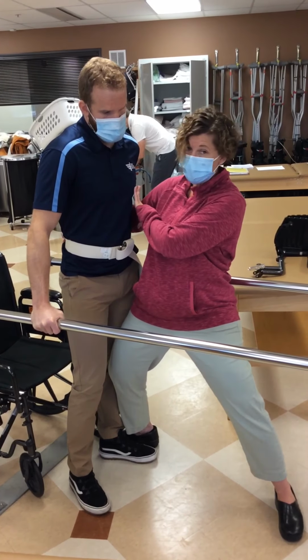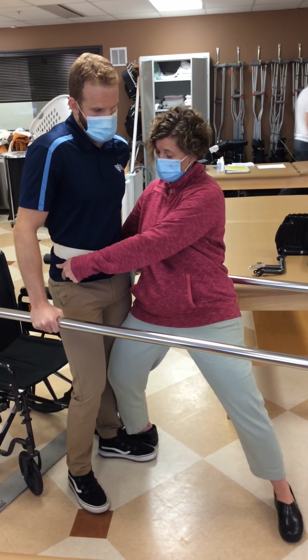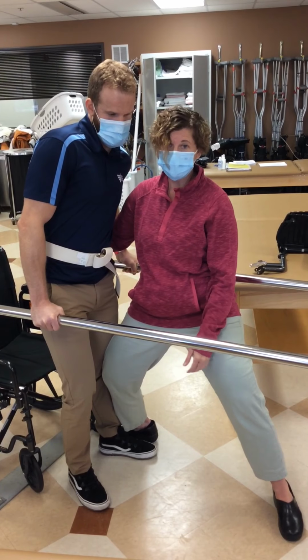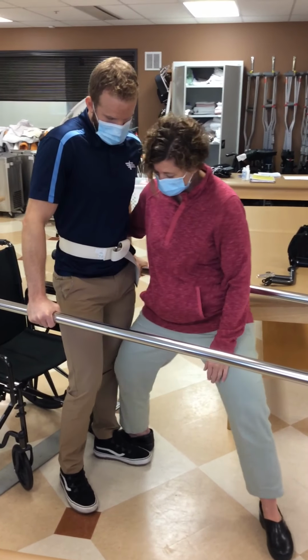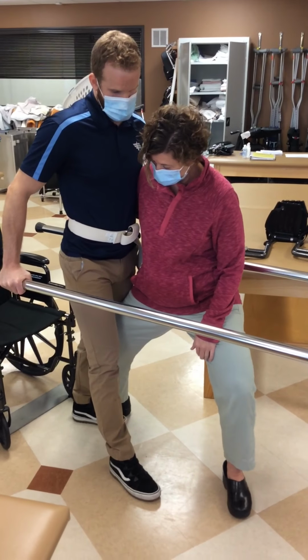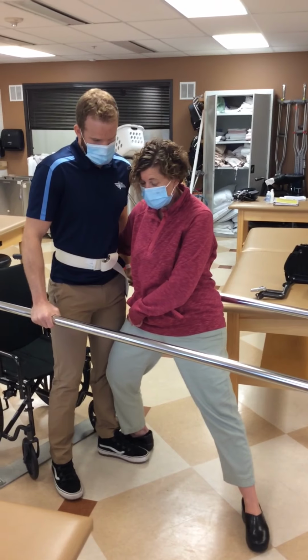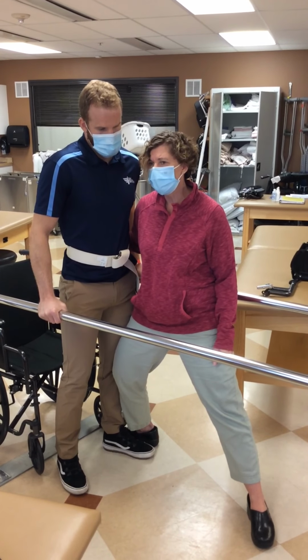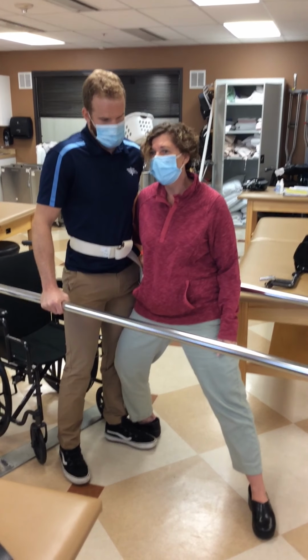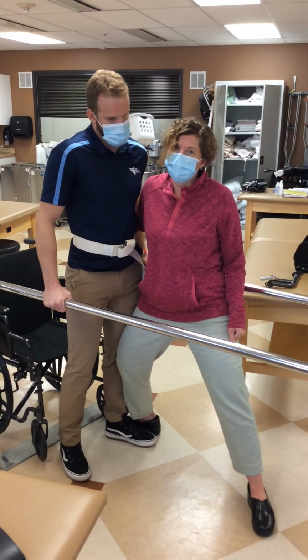So I can see if he's cheating by shifting his hips towards the affected side and just shoulders, right? And he's not doing that, so we're good. So this time, take a bigger step. Good, and now back. And on my right leg here that's supporting his leg, I'm not really forcing him into extension. I'm just providing some sensory input so I know also if he's buckling or hyperextending.